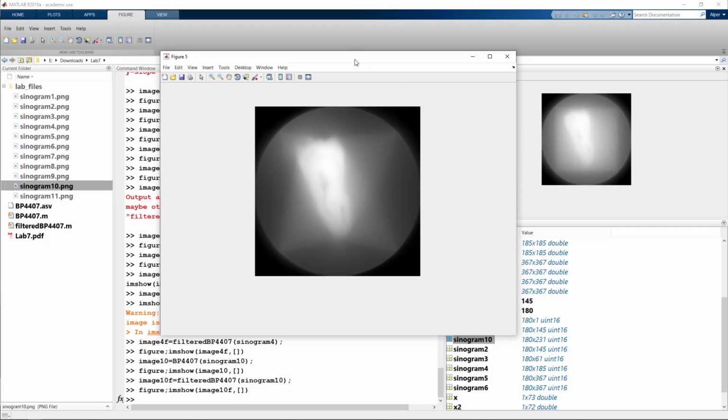It has significantly better contrast than the other one. So check the other histograms and repeat the same procedure to obtain better images. And the reason behind this need for filtering is available at the projection slice theorem video proof.